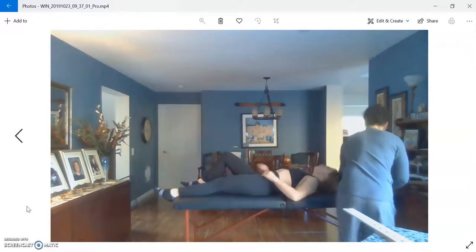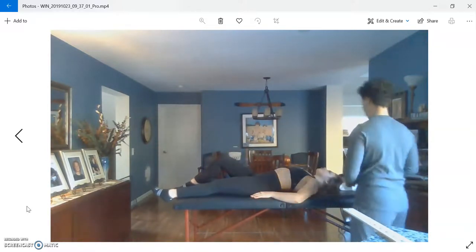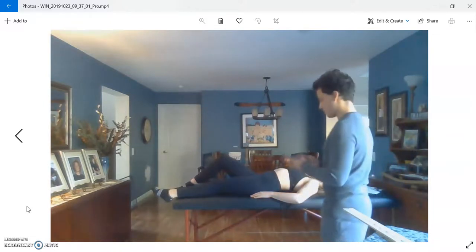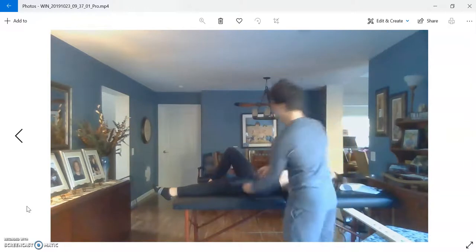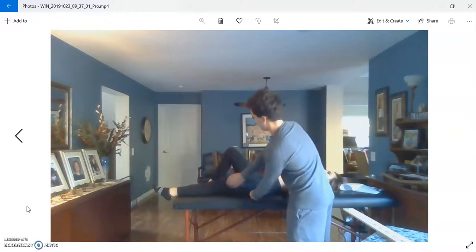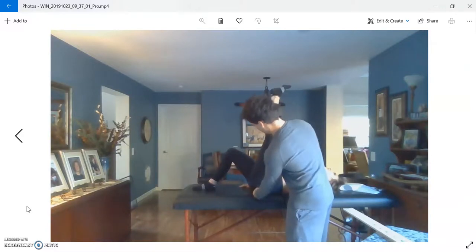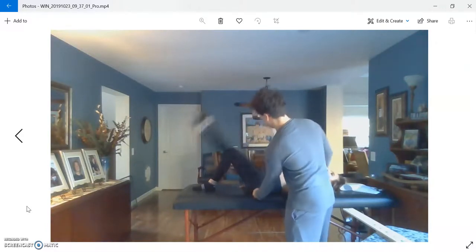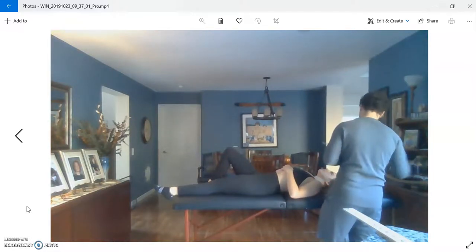After this, I have my client lay on the table. This is to measure her hip flexions, hip extensions. We're going to start with the hip flexion, having the goniometer at the lateral aspect of the hip joint, and having her flex her leg up and recording the results.